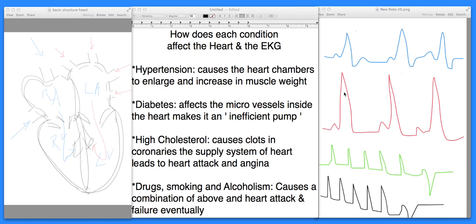And that hypertension can reflect in the EKG form like this. Look at this. This is a normal pattern on the blue strip, but on the red strip, you see how the voltage is very high? Boom, boom, boom. So these beats are very, very powerful because now obviously this chunk of heart muscle that has been added because of high blood pressure is giving high voltage, we call it. Remember, the voltage is the unit of electricity that's traveling through the heart. So that's how it reflects on the EKG.